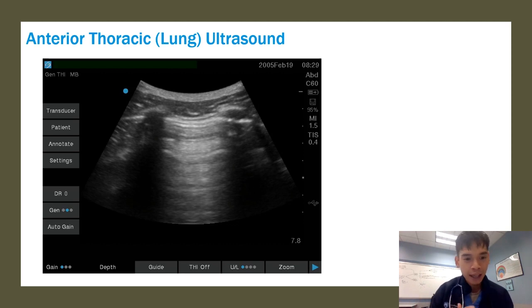In the last one, you really can't make out what exactly is a lung. And the lung is a big structure, so your relatively small ultrasound probe won't capture the entire lung, but you may see aspects of it, okay? I didn't draw a probe this time because I think we're getting it now: the probe is here, right? Whatever superficial structure is closest to the probe will show at the top, and as you go deeper, it'll be away from the probe, okay?